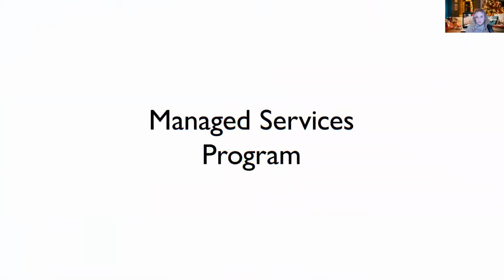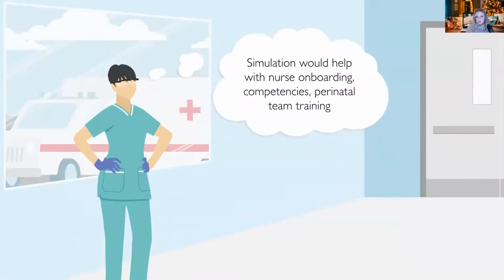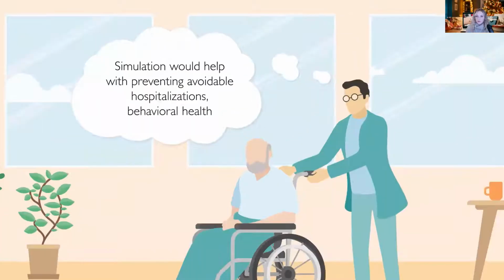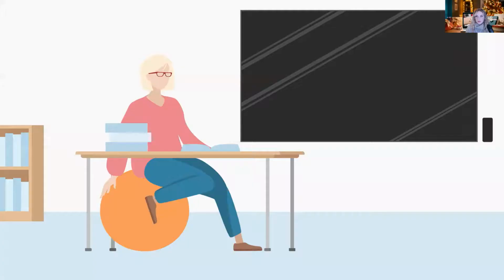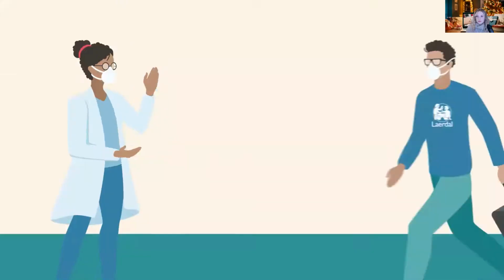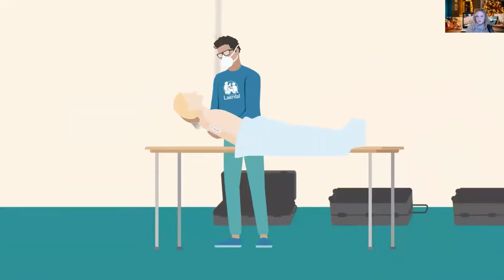That's why we created Laerdal's Managed Services Program to help break down those barriers that can hinder results. Laerdal's Managed Services Program provides simulation resources and assistance that allows rapid deployment of simulation initiatives. No matter what your curricular needs, we can deliver the appropriate turnkey training solution that will help you prove a fast return on investment and produce measurable outcomes.